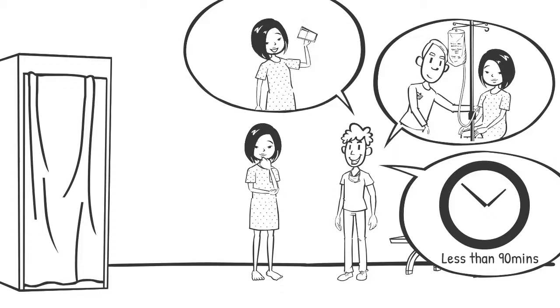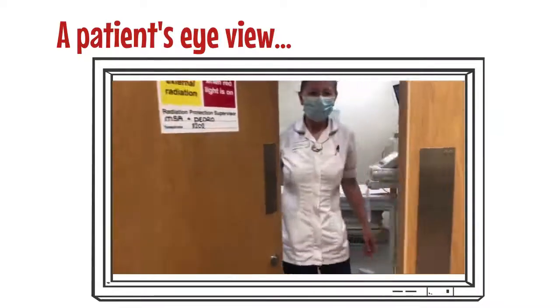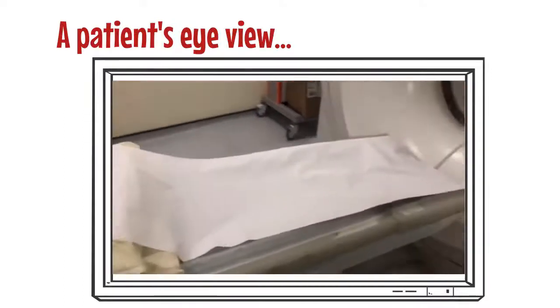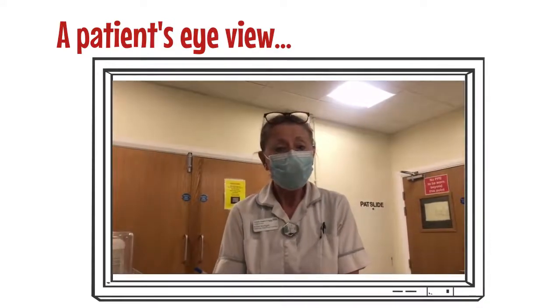When it is time for your scan, the radiographer will lead you into the room and ask you to sit on the couch. Hi, would you like to come through? Just take a seat on the bed for me. They will then ask you some questions to confirm your identity. Could you please confirm your name, date of birth, and the first line of your address, please?